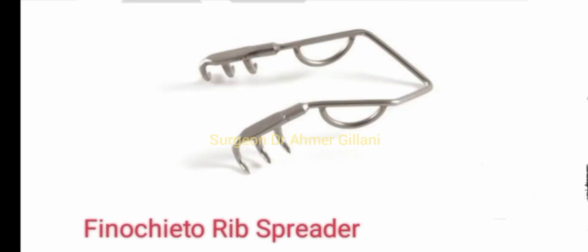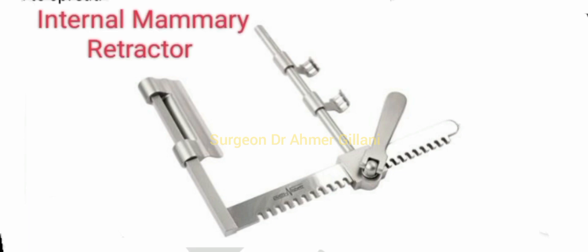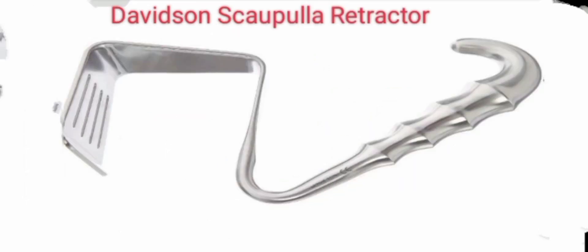Then you have the Finochietto rib spreader, and the Ankeney retractor is there on your screen. This is the internal mammary retractor and this is the Davidson scapula retractor.